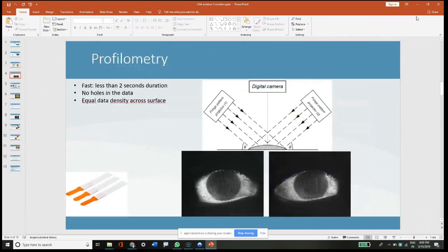So profilometry, again, like Tom explained, this is quick flash photography. This is not a placido disc type of instrument. So we do have to use fluorescein to make the sclera glow, so to speak. I know Dr. Richland says something like the camera only sees yellow, and that's a really good way to put it, because you do have to get a lot of fluorescein in the eye.